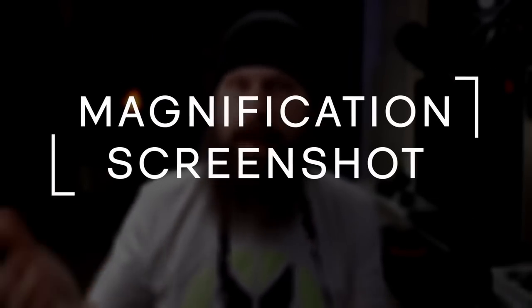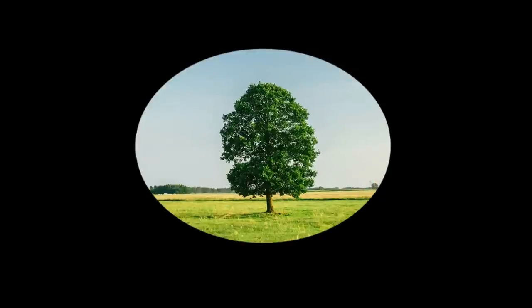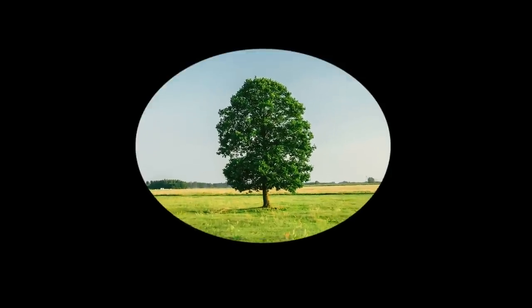The basic functions are magnification and the ability to take a screenshot. Magnification goes up to eight times, and the lowest magnification is still zoomed in a little bit from what you would naturally see. It also looks like it has some built-in stabilization, which is always nice. When you're zoomed in at the higher magnification — eight times — and looking at something in the distance, it's not going to be shaking around and hard to focus on.